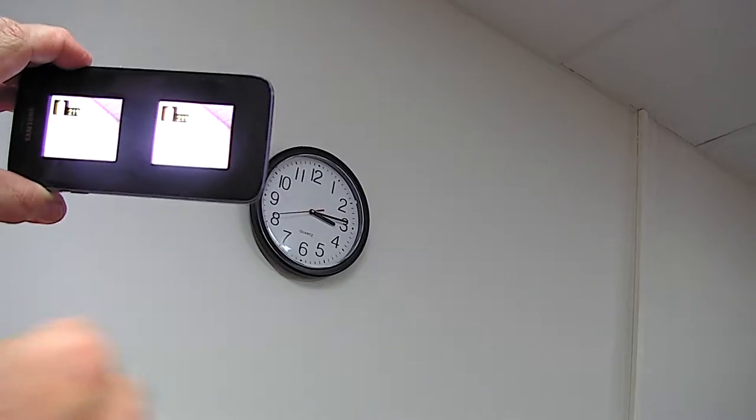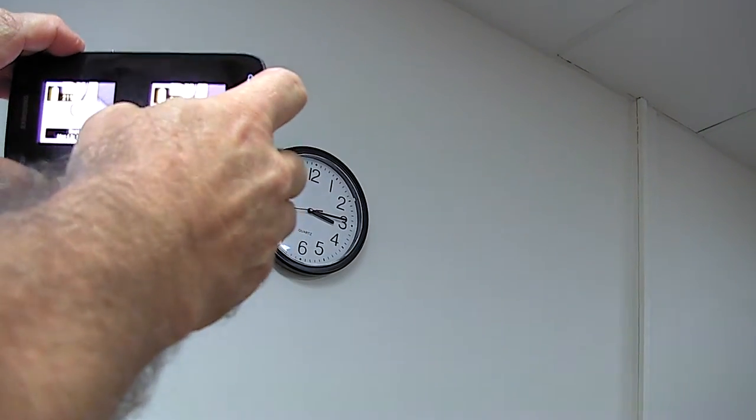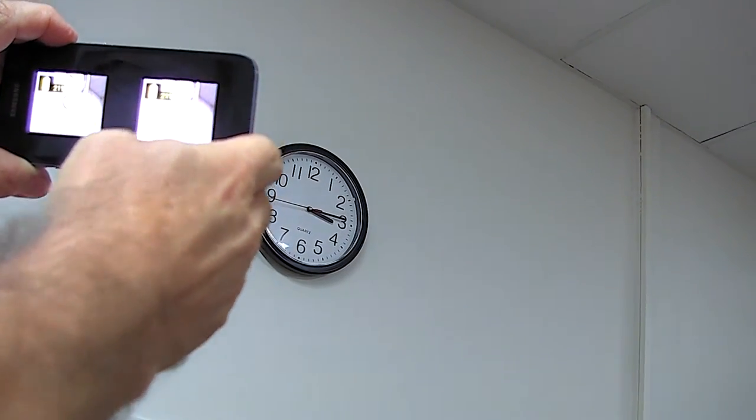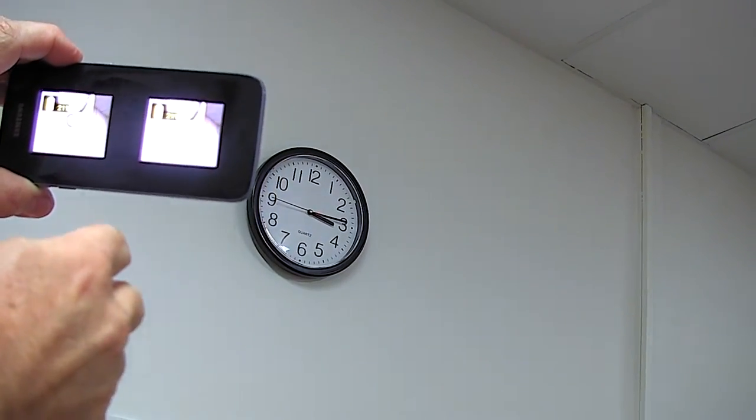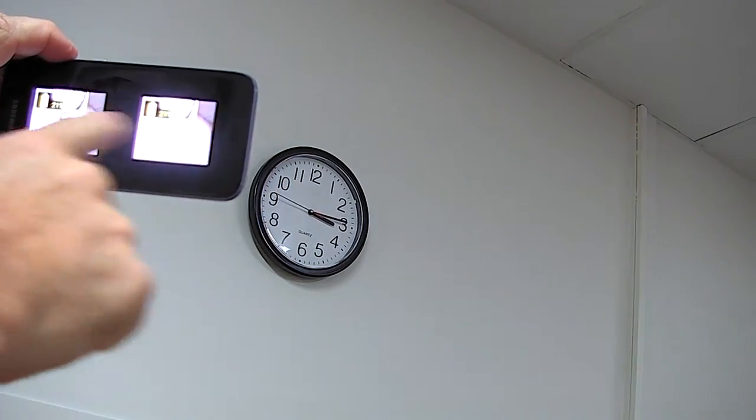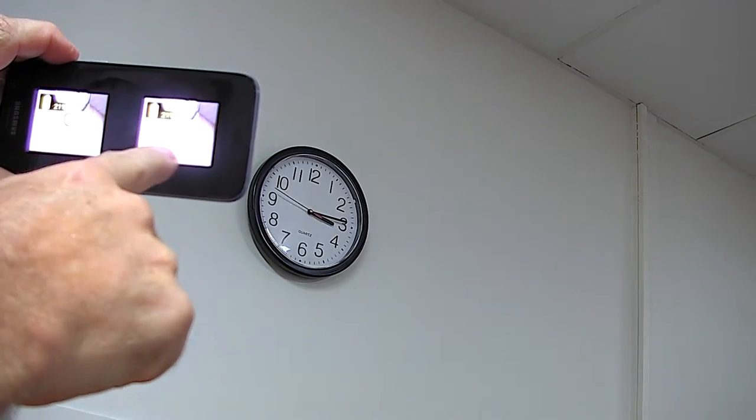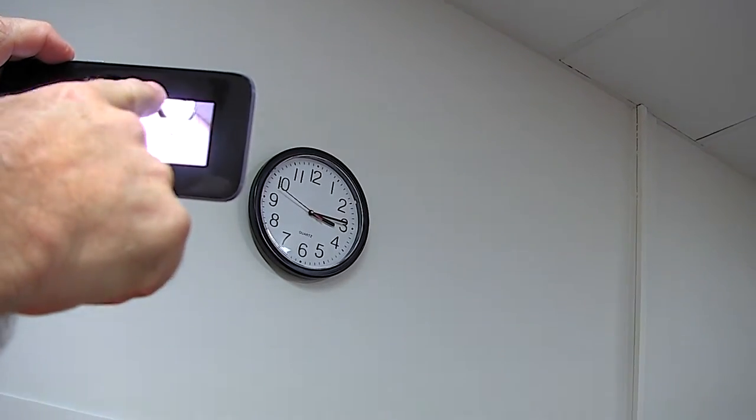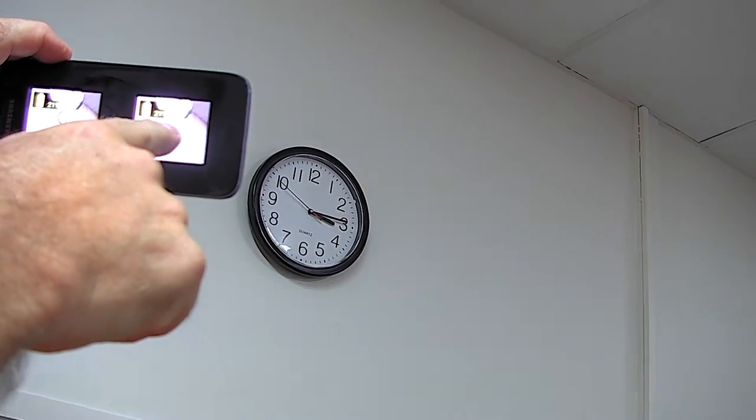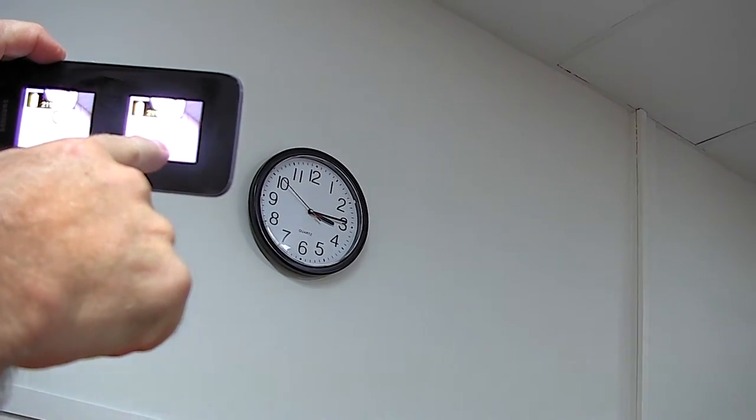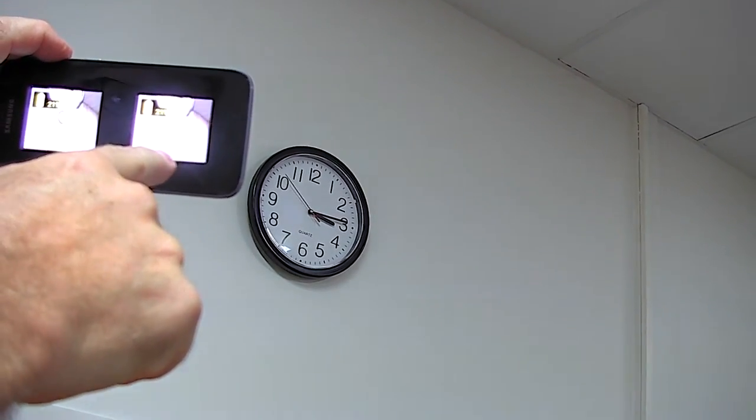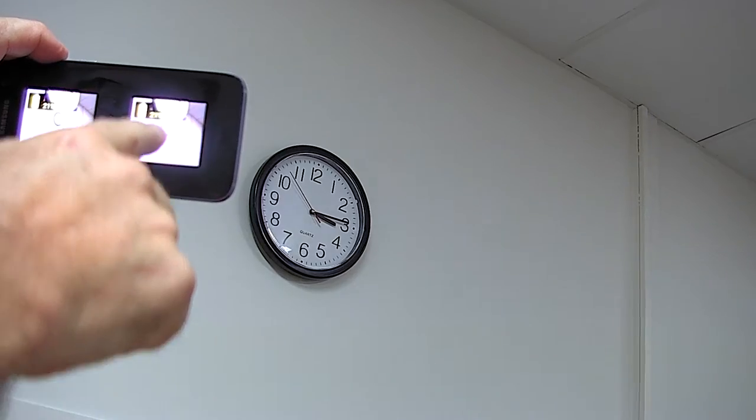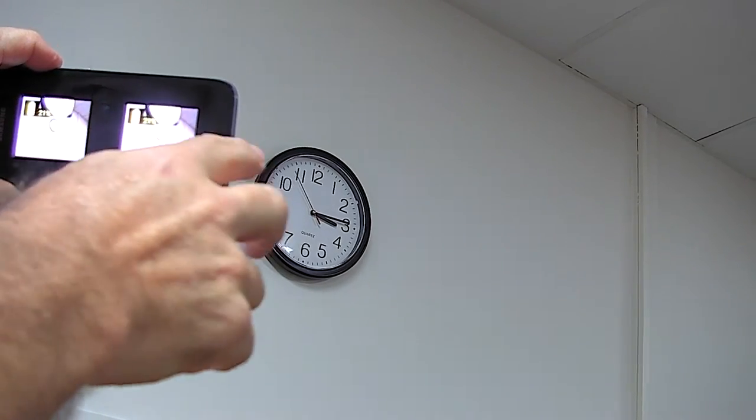Now there are some other views. We can have what's called a bioptic view, which is unmagnified below but has a magnified lens at the top. You turn your eyes up slightly to get a magnified view.